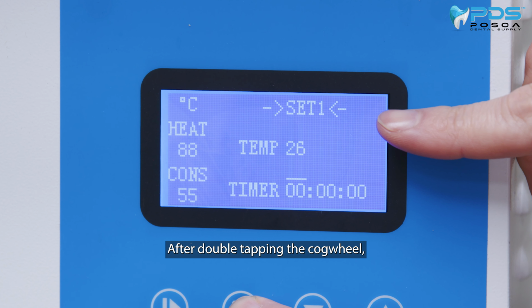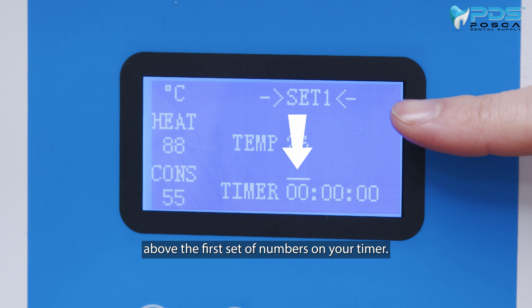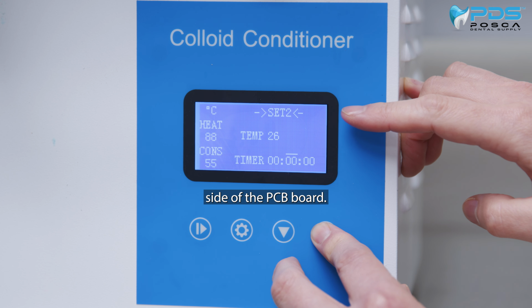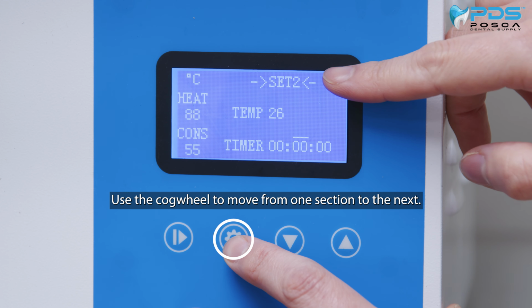After double-tapping the cogwheel, you will enter into Set 1, and you will see a line appearing above the first set of numbers on your timer. Using the up or down arrows on the right-hand side of the PCB board, adjust the timer to 0. Use the cogwheel to move from one section to the next.